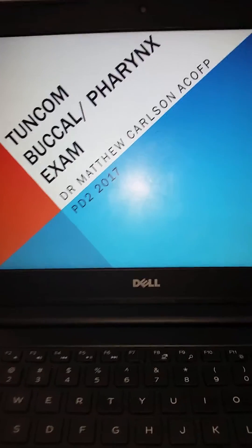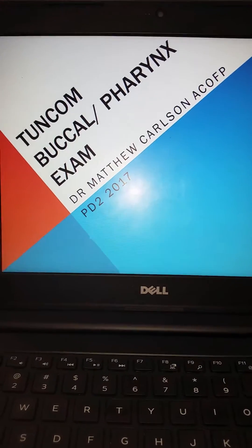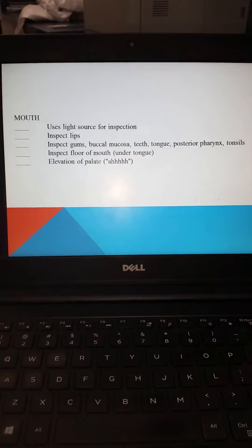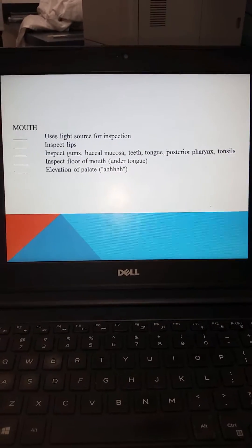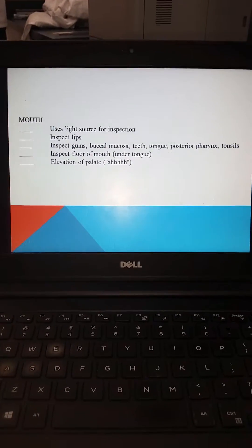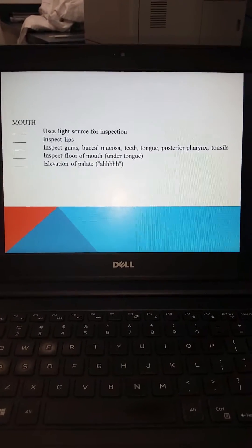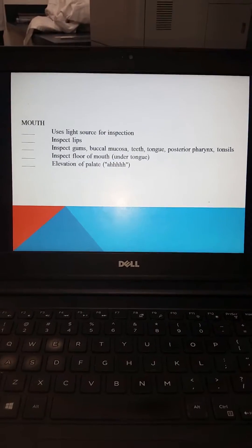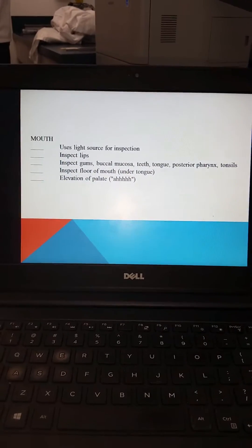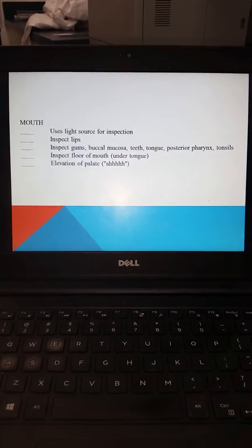Welcome back everyone for physical exam, physical diagnosis 2, for the buccal pharynx examination. During this examination, the skill sheet you have been provided with demonstrates and talks about uses of a light source. We'll be using an otoscope, or you can use a pen light with a tongue depressor. You're going to inspect the patient's lips, gums, buccal mucosa, teeth, tongue, posterior pharynx, and tonsils. You will ask the patient to lift their tongue to examine under the tongue, as well as have the patient say 'ah' to elevate the palate, checking for cranial nerve dysfunction.